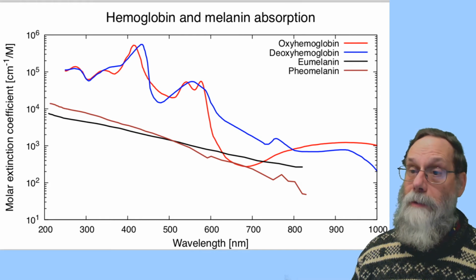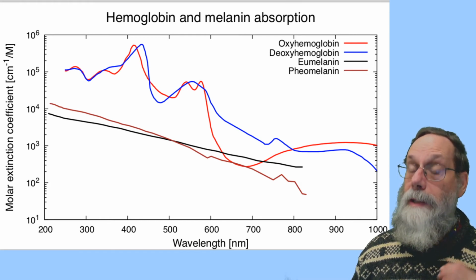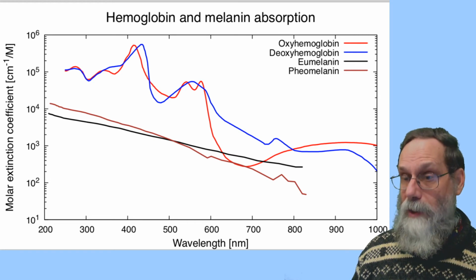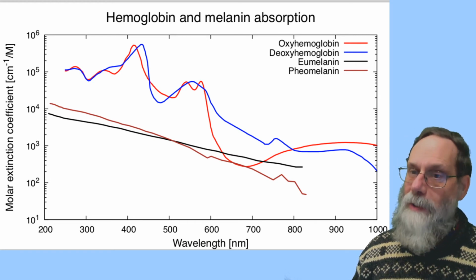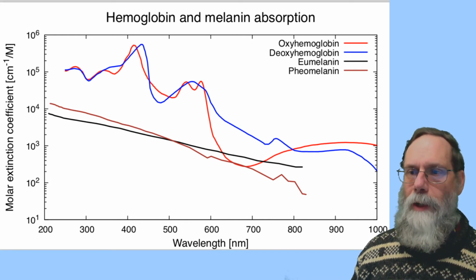The pulse oximeter takes a while to make a measurement because it has to detect the pulse and it has to then synchronize its measurements with the pulse so that it can look at just that fluctuating part.